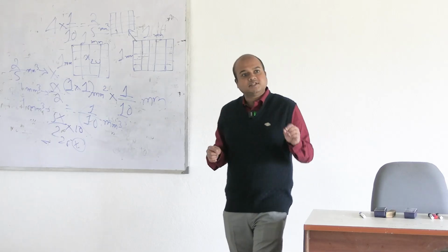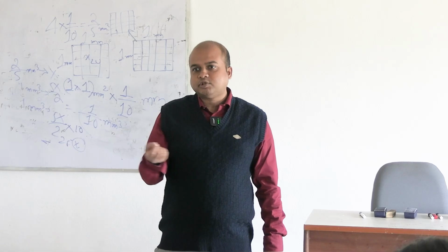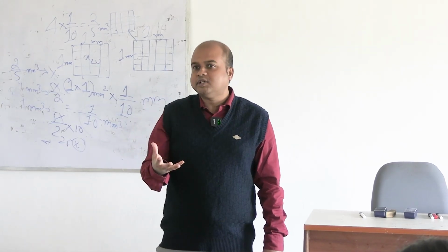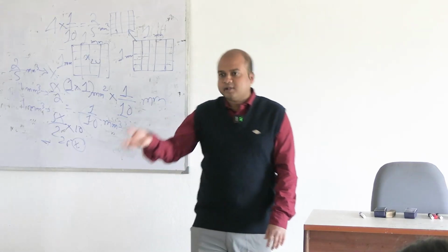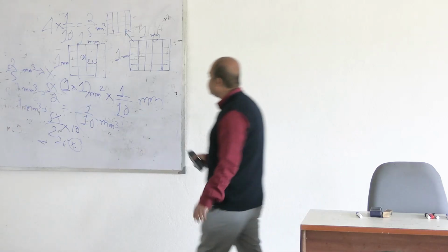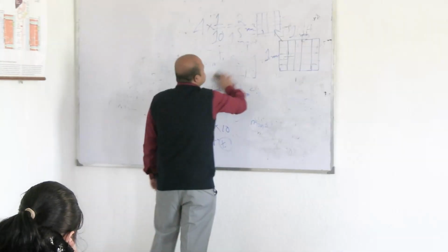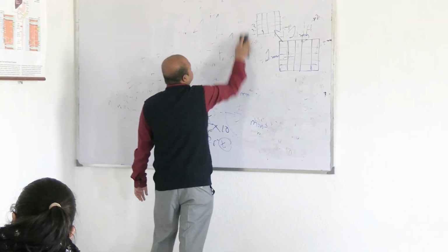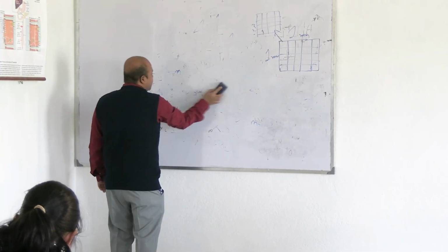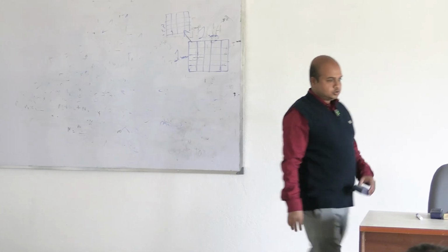Even after proper charging, the cells look nice, and by nice I mean that structurally we can identify these are the RBCs, but they are so huge in number without proper dilution that it is not possible to count them. So that's why proper dilution is very important. And it has been standardized that we dilute 20 times for WBCs and 200 times for RBCs. That is, don't take blood more than 0.5 and don't take less also.